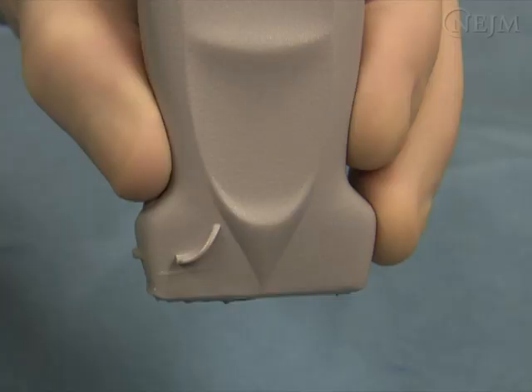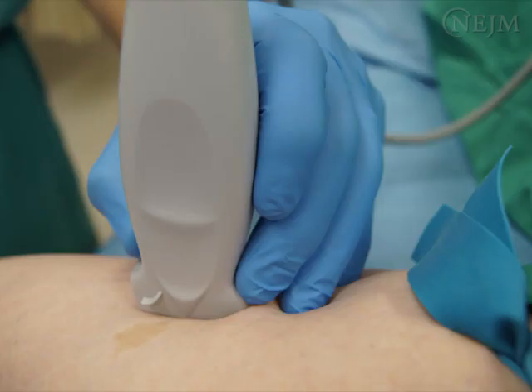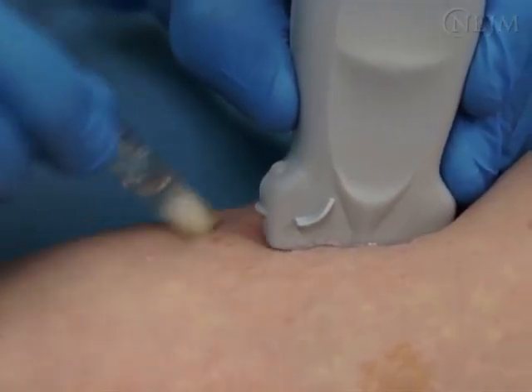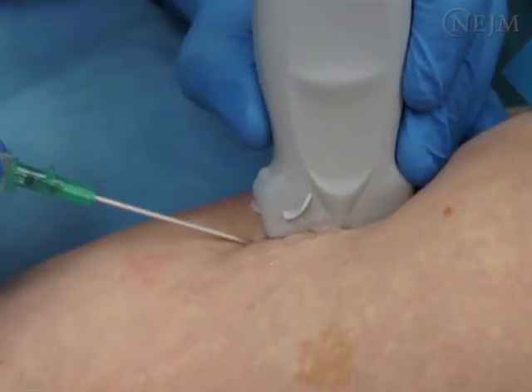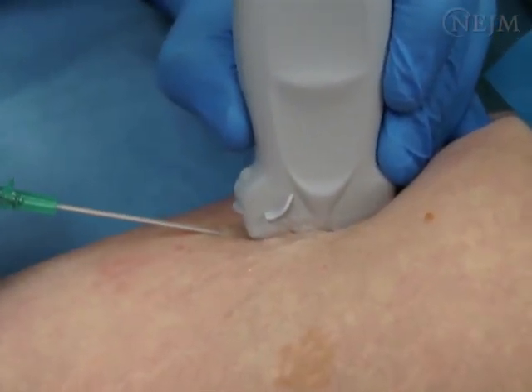Hold the transducer with your thumb, index finger, and middle finger. Place your other fingers on the patient's skin so you can hold the transducer completely motionless during the procedure. Use an antiseptic swab. Carefully align the needle before insertion so that the trajectory will be precisely within the ultrasound plane. Puncture the skin just distal to the transducer.